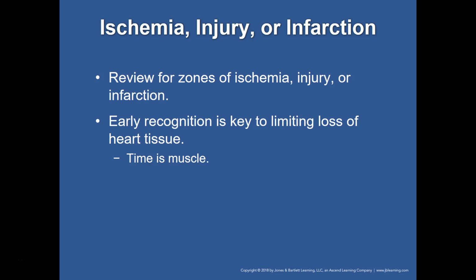We're going to change formats once or twice here when we get to looking at 12 lead and the location of injuries and such. We'll go to a different screen and we'll see how all this works out. It's probably way too technical for me, but whatever. We'll figure this out.